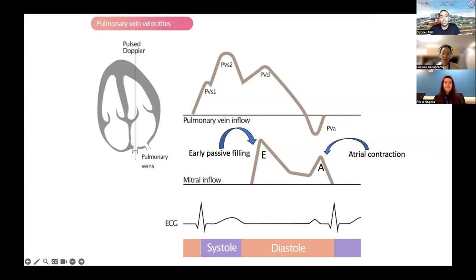And so the different waves inform you on different portions of the cardiac cycle. So typically you're going to have your early filling and then your atrial kick. And you can see that during the atrial kick, sometimes you get a brief period of reversal. The duration of that, at least in adults, has been correlated with some degree of diastolic dysfunction, although this marker has been abandoned by the recent classification of diastolic dysfunction in adults, to be honest, because it's very variable and it's not always obtained.